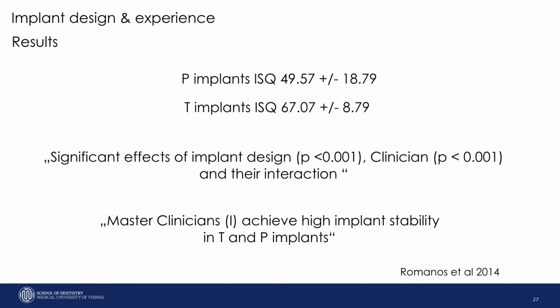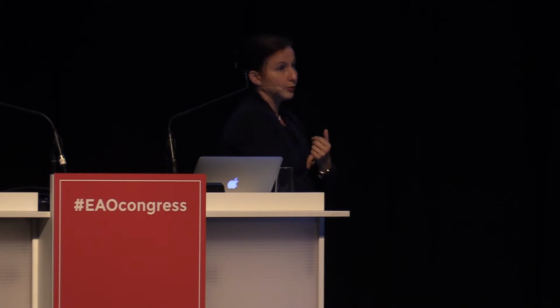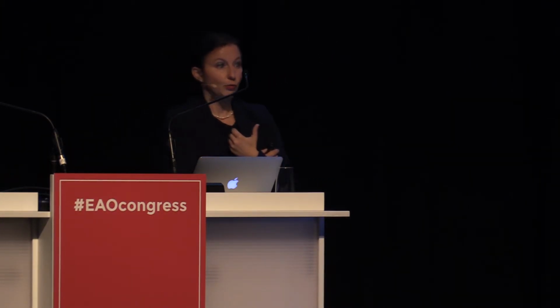There was a significant effect of implant design in clinicians, which means the more experienced ones reached high implant stability also with the parallel walled implants. And the master clinician also achieved high implant stability with tapered implants. So when you're experienced, the implant design does not make a big difference. But when you're a beginner, the tapered implants really give you more from the learning curve.